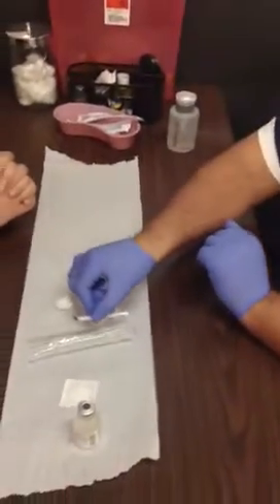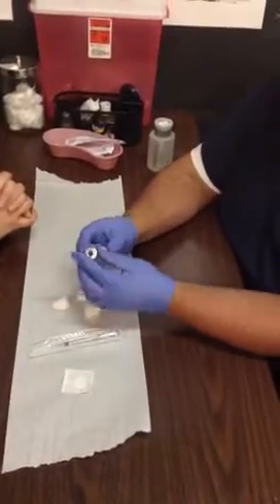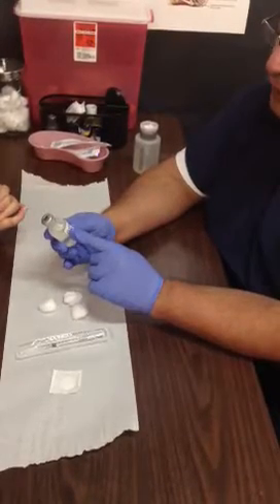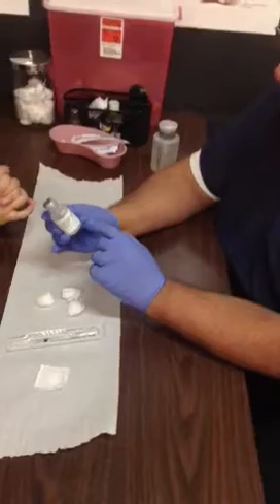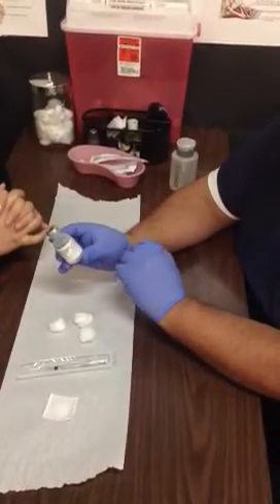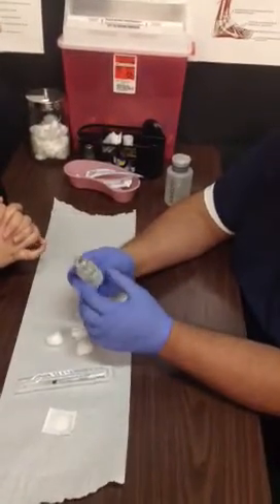Set the syringe back down into its sterile cradle. Now we're going to make sure that we have the right medication — this is our first label check. Read everything on the label, make sure you have the right medication, make sure it's not expired, and read any instructions regarding the medication. It looks like we have the right medication.